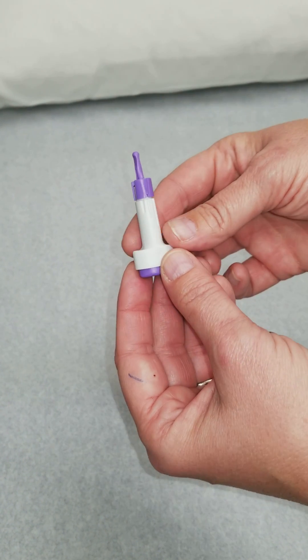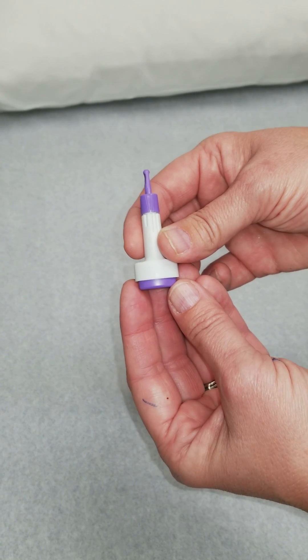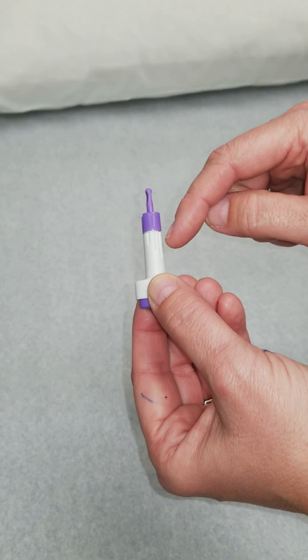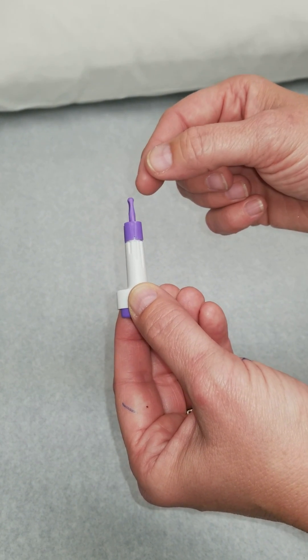This is the lancet. I just want to show you because it's a little bit tricky when you first hold it in your hands. This is the button that you push that displaces the needle up inside of here to actually lance the patient's finger.